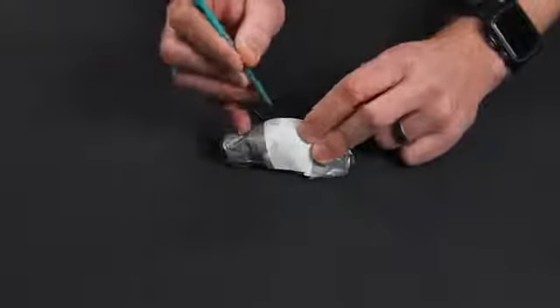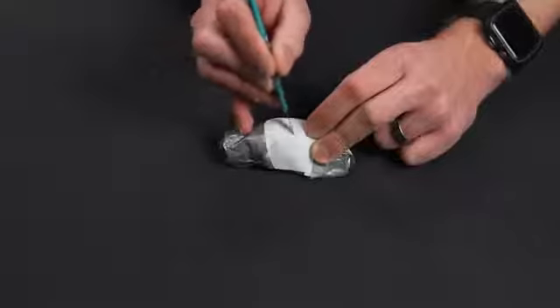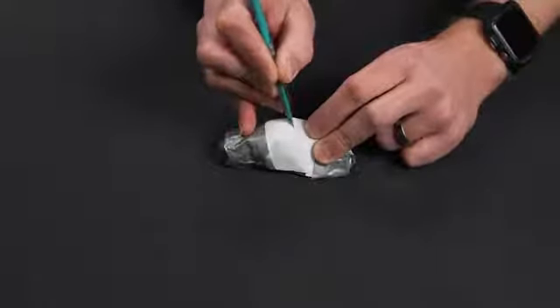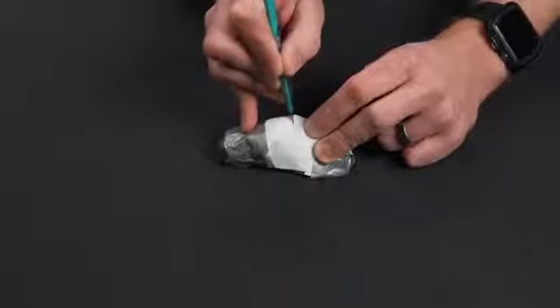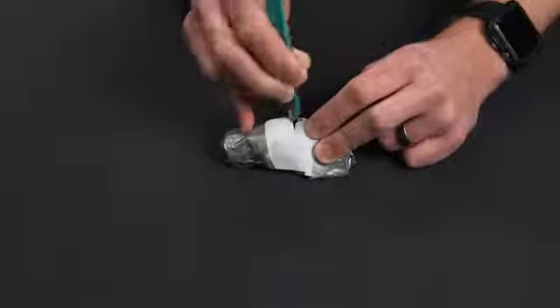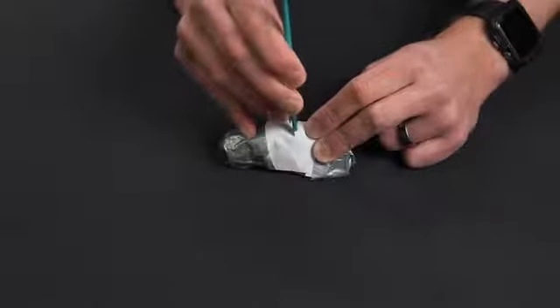So to do this one here, we found the landmark, sterilized the site as appropriate, and I'm going to take this scalpel and we're going to make a cut down into the membrane. I'm going to take it all the way to one side of the membrane and the skin. It will stop once again. I'm going to twist the scalpel 180 and I'm going to move to the other side.